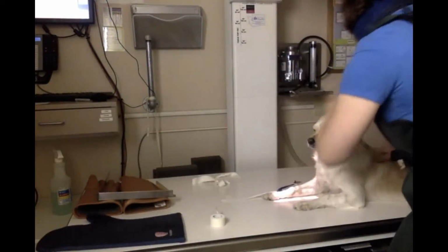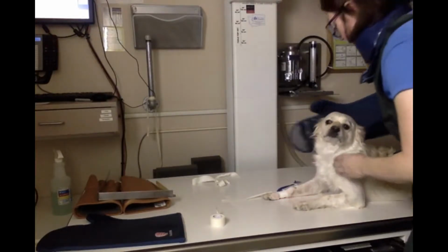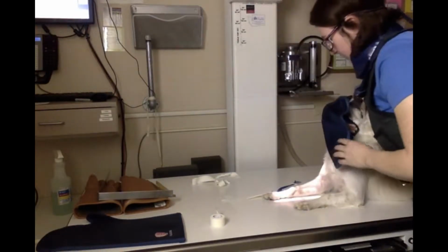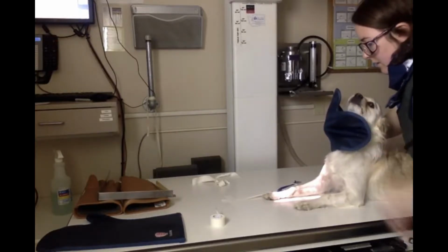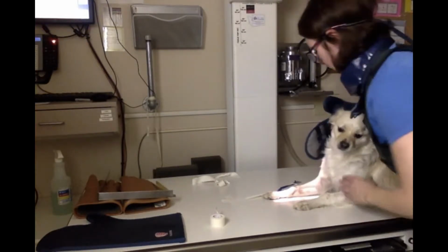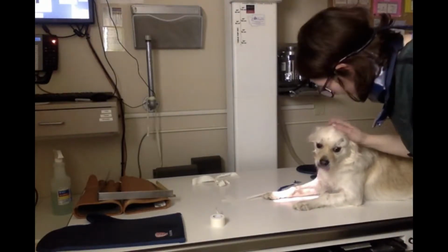And since he's being a good boy, no one else needs to be in here with me, so I just need to make sure I get his head up and out of the way. Oh, that's such a good boy. Just going to make sure my alignment is good. That looks wonderful. Keeping everything not exposed out of the primary beam. And then take my image. Oh, that looks beautiful. You are a good dog.